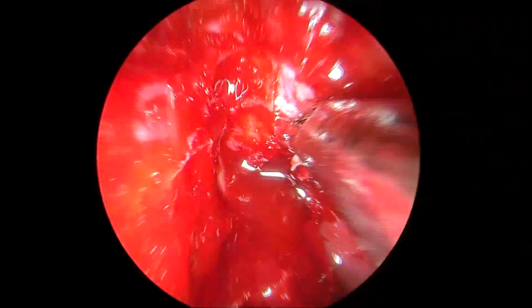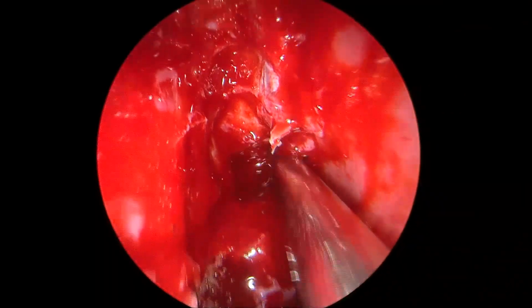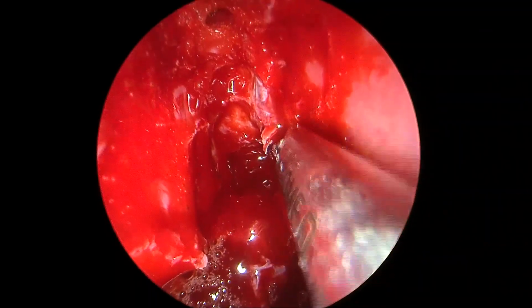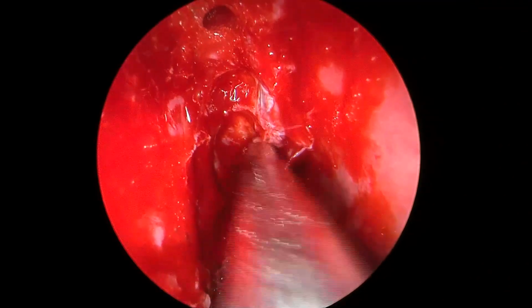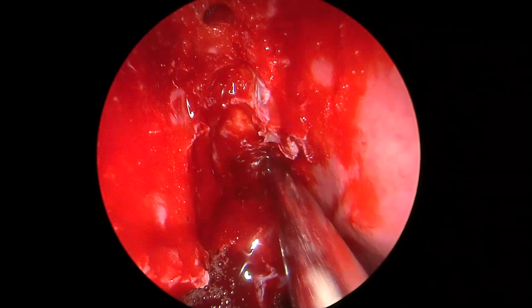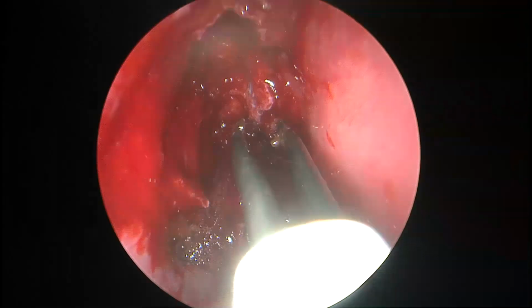As you see here, this is a skull base defect that we have located. The sac of meninges you can see very well. These may or may not leak actively at the time of surgery, but they are still prone to meningitis, so they are always surgical treatment. We can see the lamina exposed laterally on the right side, the septum medially.